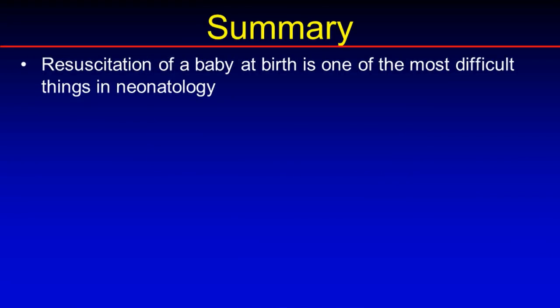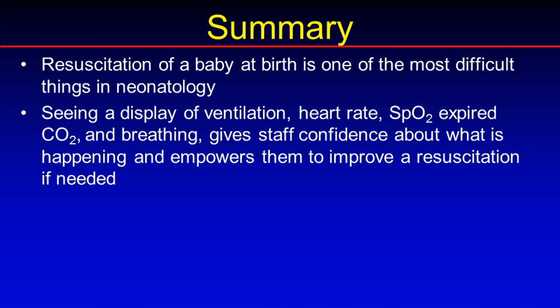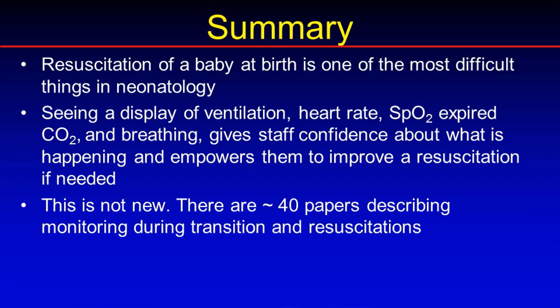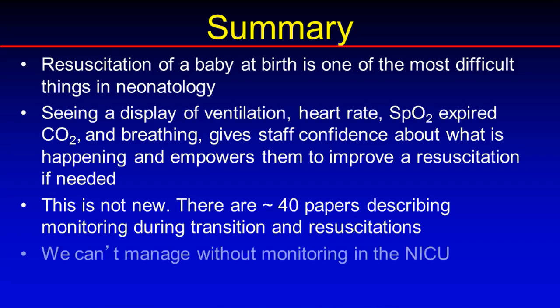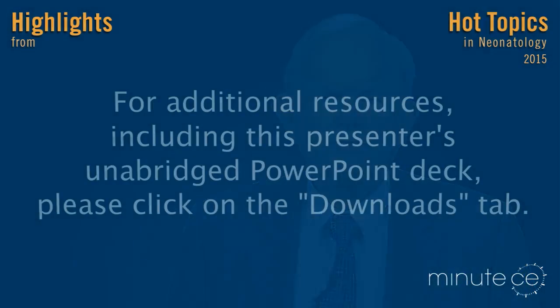So in summary, resuscitation of a baby at birth at the moment is one of the most difficult things in neonatology, and it's almost all subjective. The future is going to be, just like in the nursery when you're ventilating, that if you can see a display of the ventilation and all those other things, it gives the staff confidence about what's happening and empowers them to improve the resuscitation. This is not new. There are now over 40 papers describing monitoring during transition and resuscitation. We can't manage without monitoring in the neonatal unit, and the future's got to be we should use monitoring in the delivery room. Thank you very much.